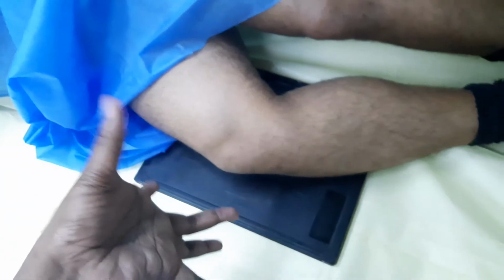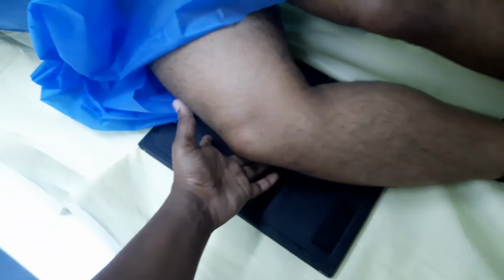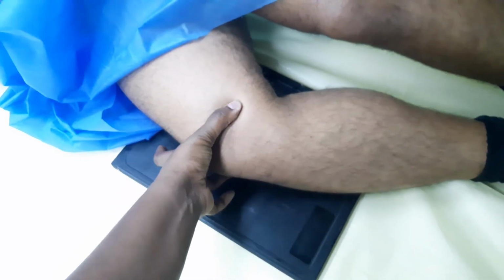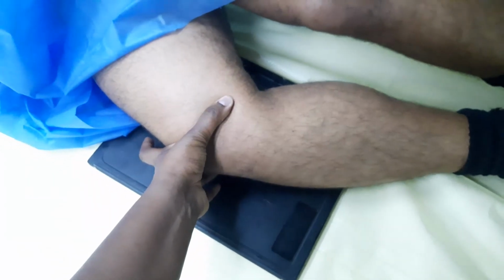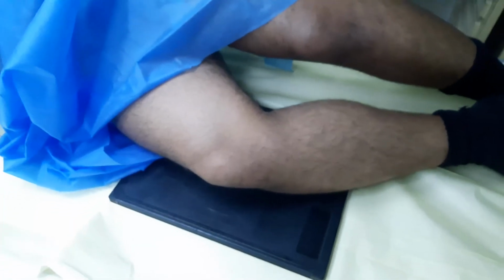And then you feel, or you palpate. This is another tip, right? Palpate for the epicondyles or the condyles to make sure that they are over each other. So what I do, I usually take my thumb finger and my middle finger. I use the middle finger to palpate the lateral condyle and the thumb finger for the condyle on top. And I make sure that it lines up, right? So tilt the foot down a bit. And now the knee is in a more lateral position.